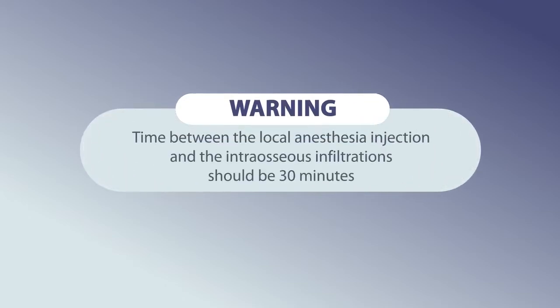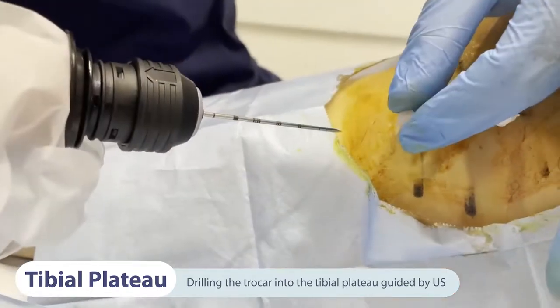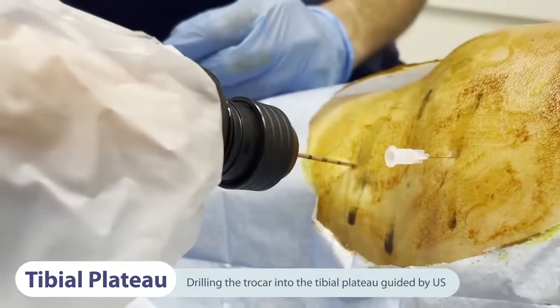It is important to wait at least 30 minutes between the local anesthesia injection and the intraosseous infiltrations. The first step is to assess the effectiveness of the anesthesia by palpating the area before drilling the tibial plateau and asking the patient if he feels anything. The whole procedure is performed under ultrasound guidance.